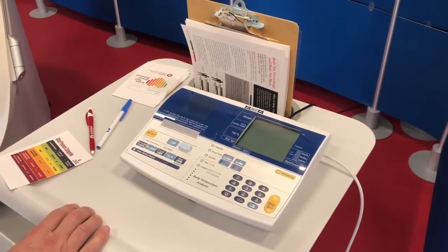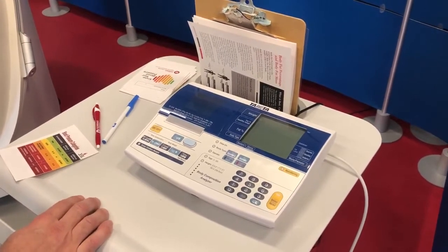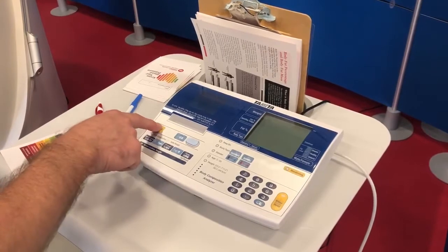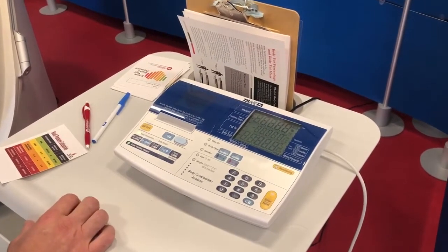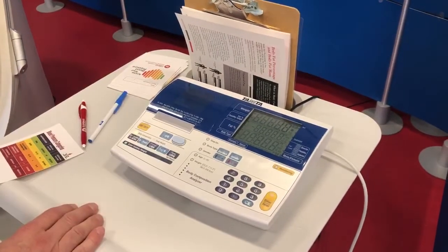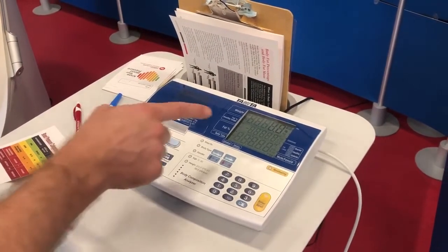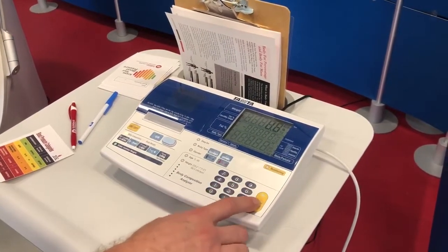For the BIA, you're going to want to make sure that the scale is clean, and you have to make sure that your client removes their shoes and socks. You're first going to turn on the BIA by pushing the power button. Once the BIA is set, ensure that there is paper within the Tenita Bioelectrical Impedance. Next, we're going to enter in our weight for clothing, which is 0.6, and then we press enter.